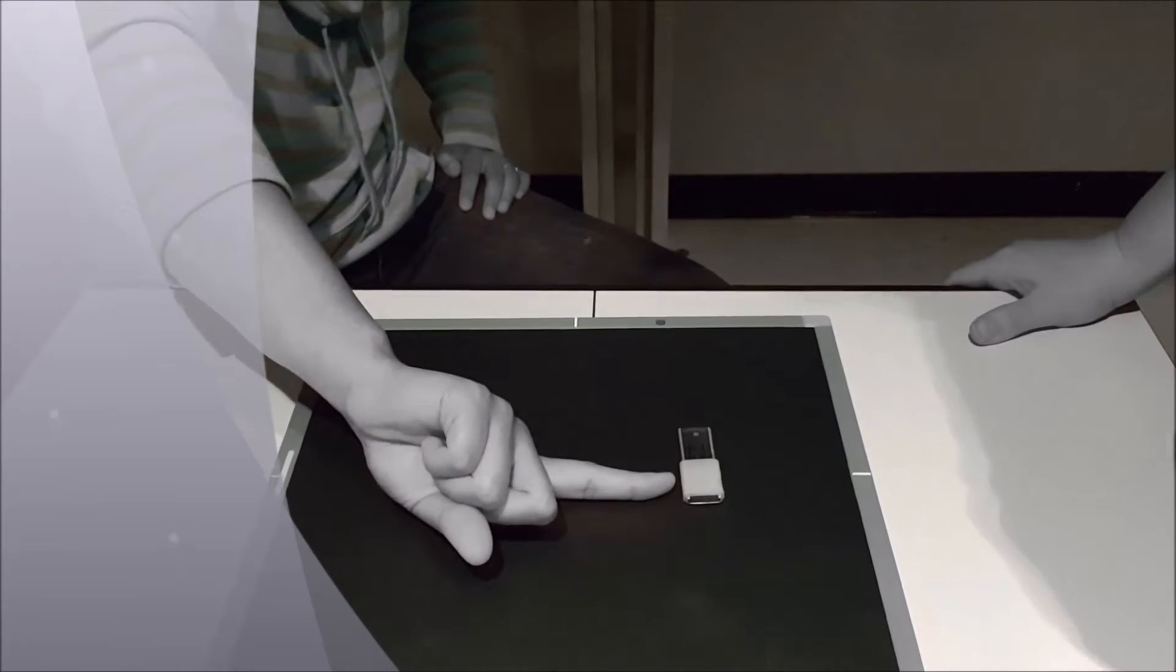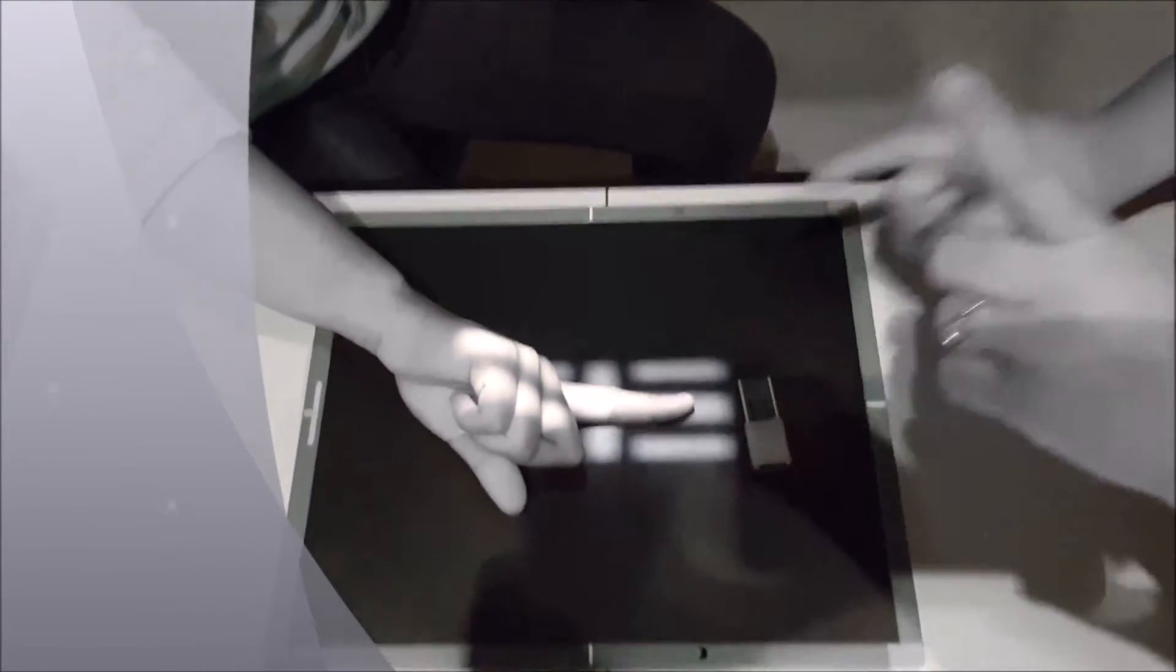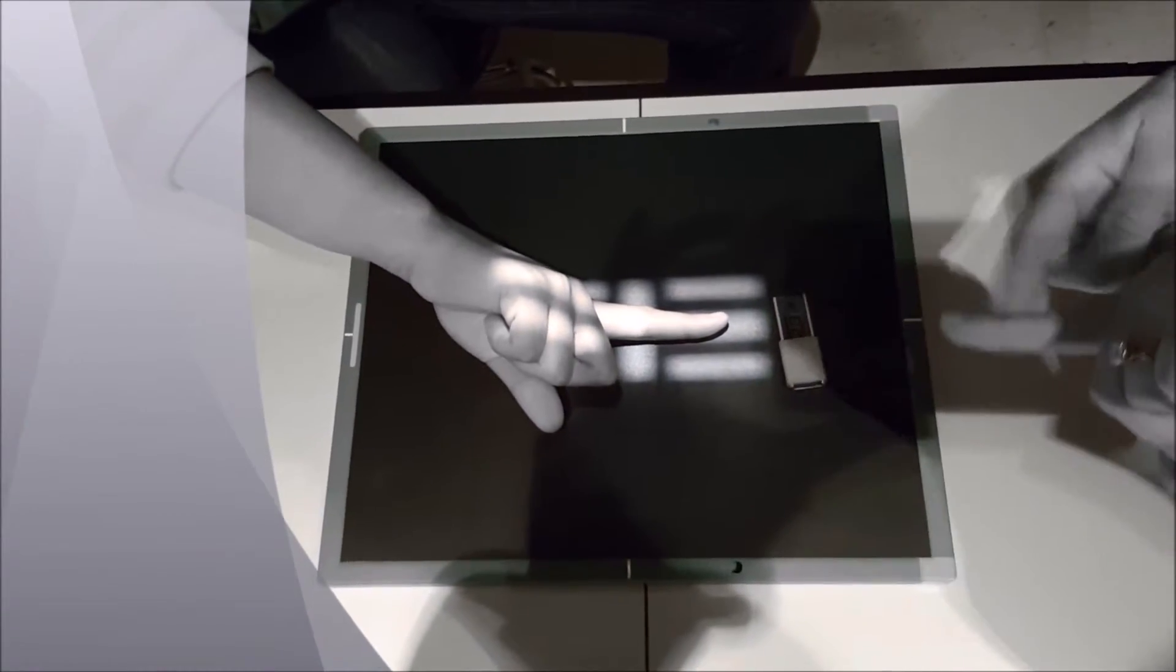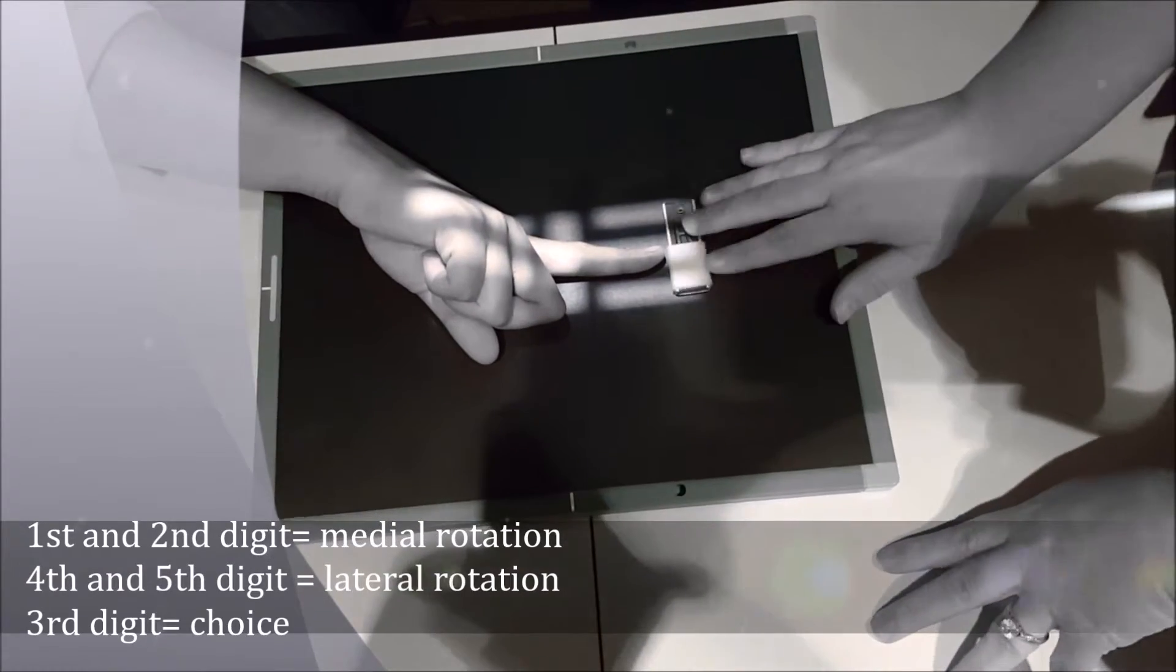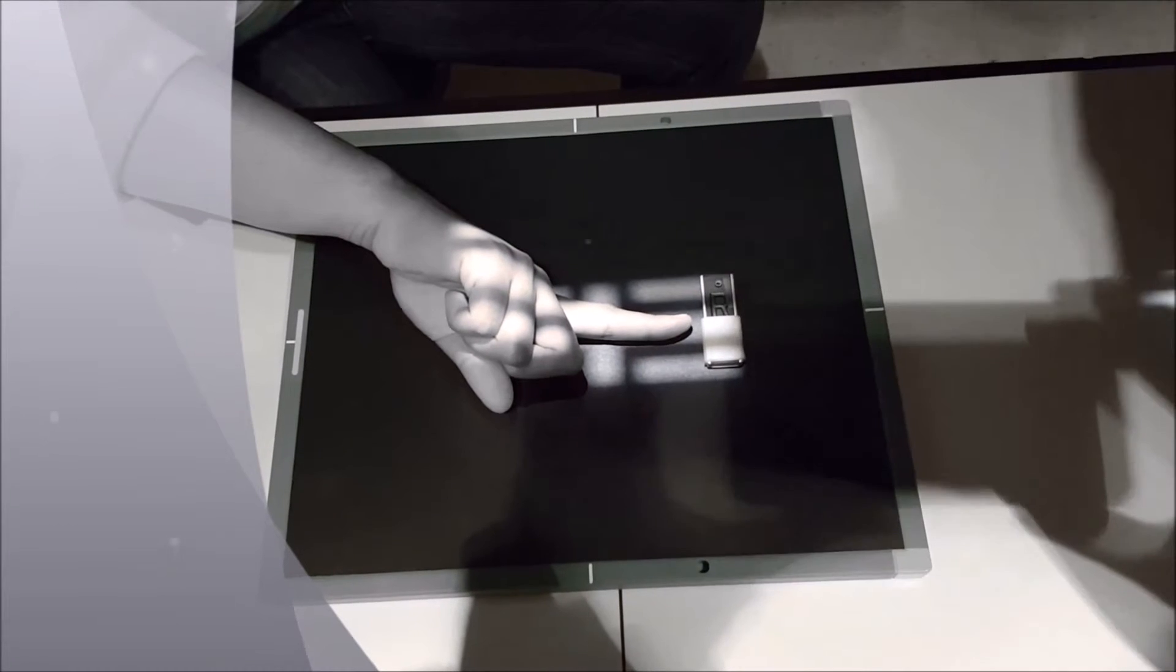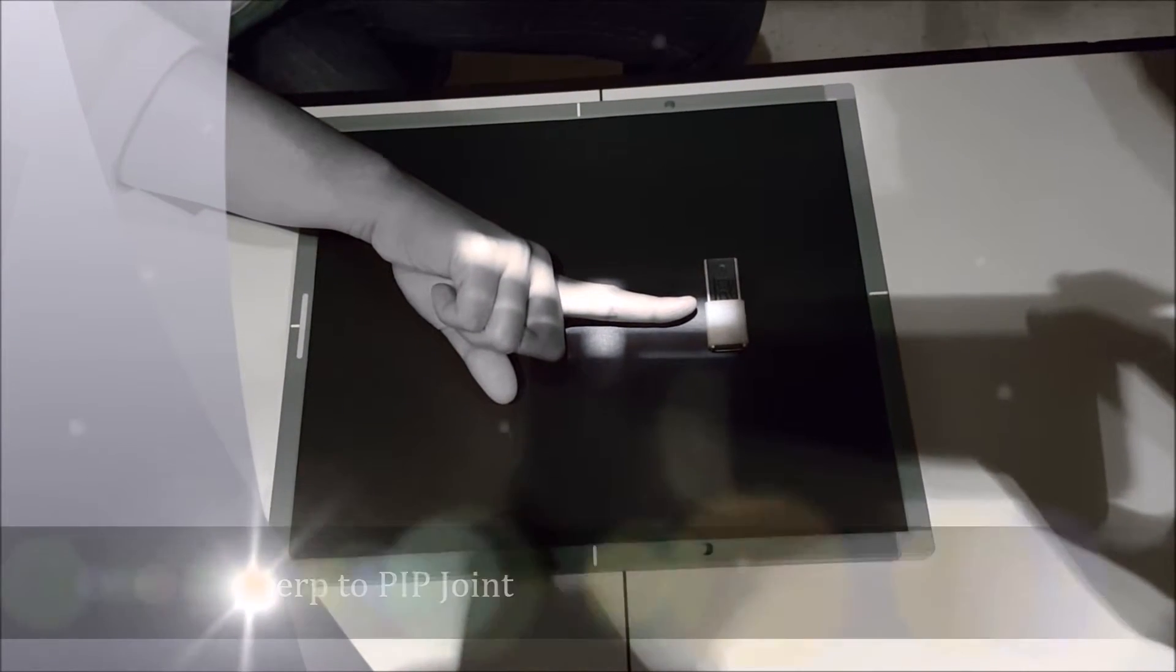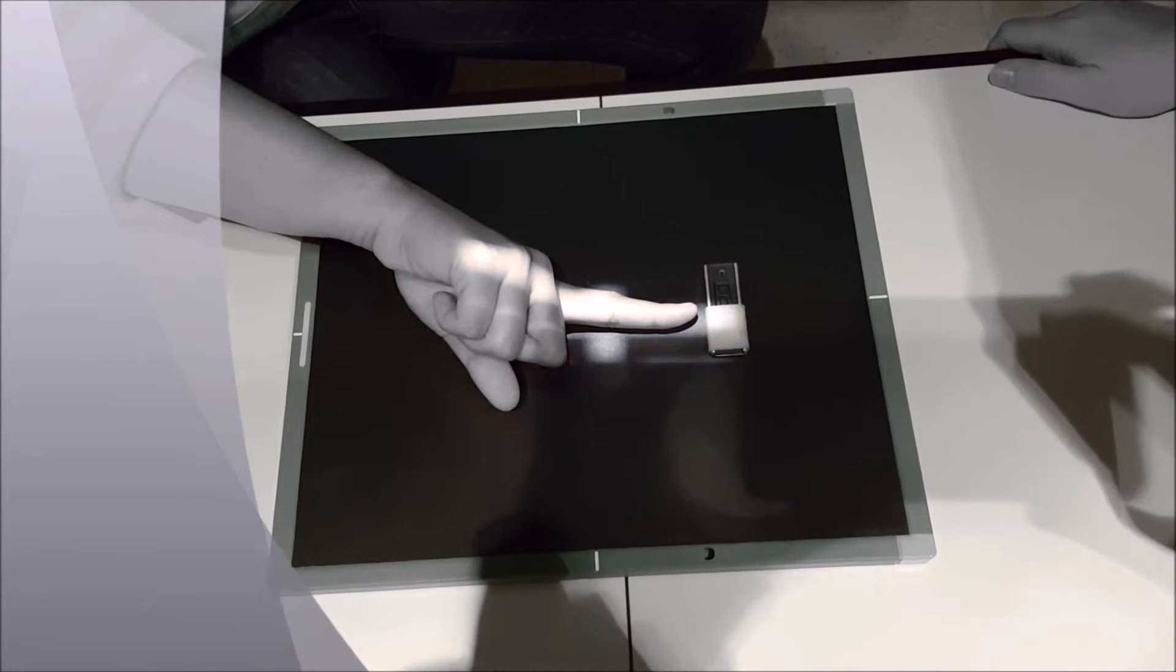For a lateral digit, it's going to vary depending on the digit in question. If we're talking about the second digit, you're going to put that digit closest to the IR, so you're going to immediately rotate their hand. Still centered to the PIP joint. We're going to collimate. We're still at 40 inches, and again you'd be using an 8x10 cassette.